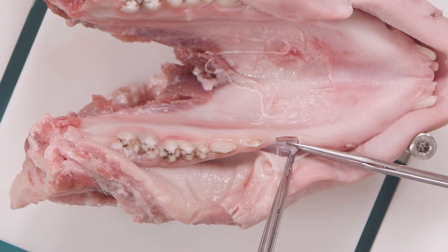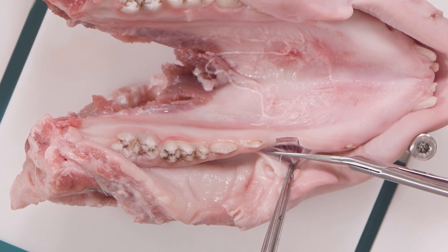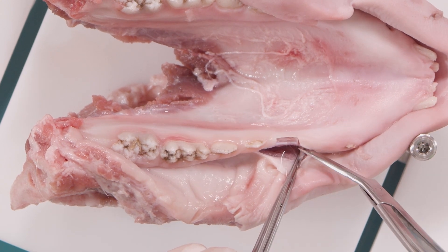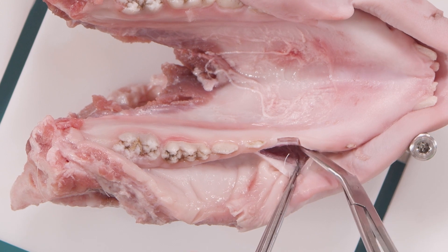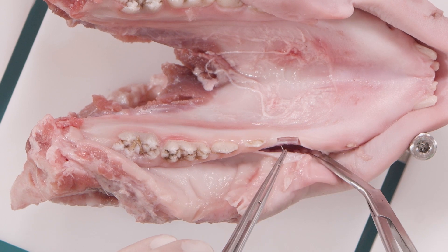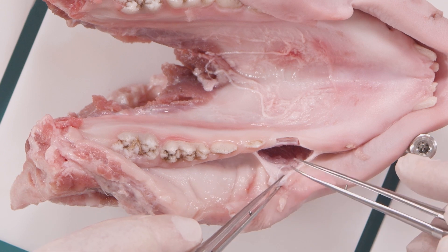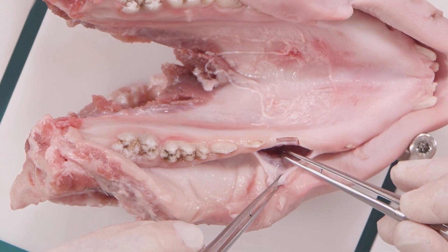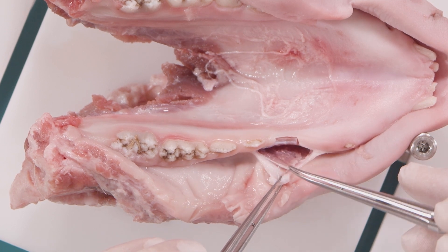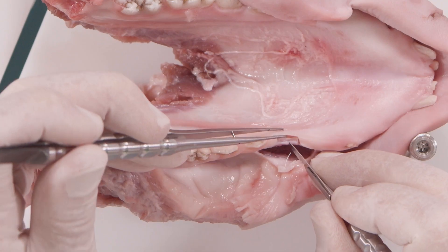Now you see how I remove the mimic muscle, but we still leave the periosteum to the bone. Now the mimic muscle is separated from the periosteum. The next step is the local removal of periosteum.